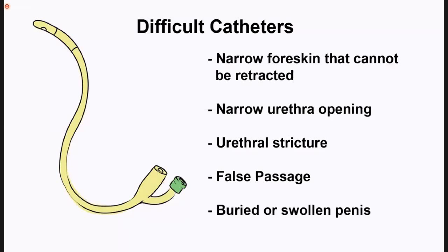Some of the catheter scenarios that we commonly encounter in a ward situation is what we affectionately call the self-TURP. And that is where a patient will subsequently remove a catheter forcibly, and that will cause some trauma and some bleeding. In those instances, you can safely place another urinary catheter.